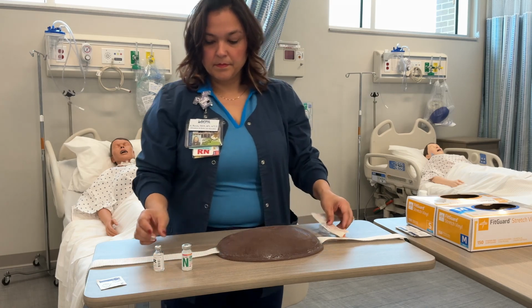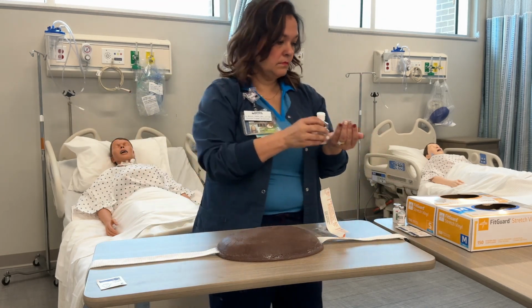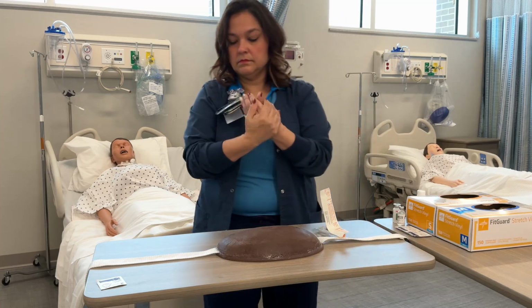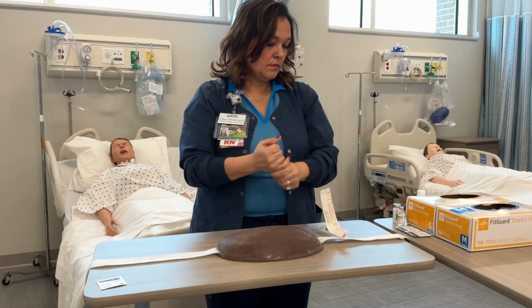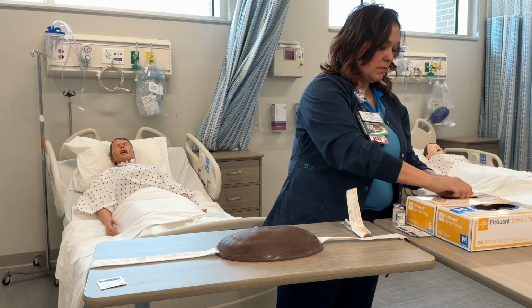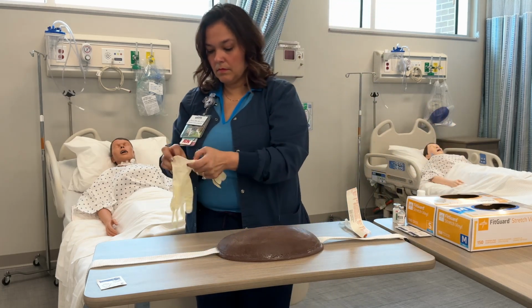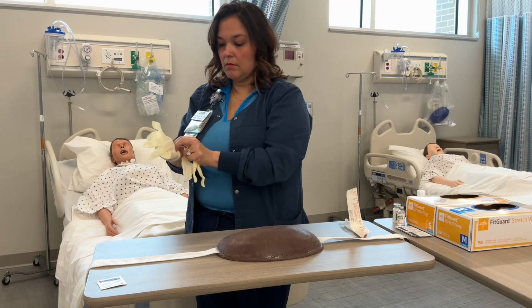All right, so once we get to our patient's room, we're going to wash our hands, perform our 3 medication checks. We're going to ask our patient where they got their insulin injection last, and we're going to select the correct site for injection, making sure you're rotating sites. Don clean gloves.